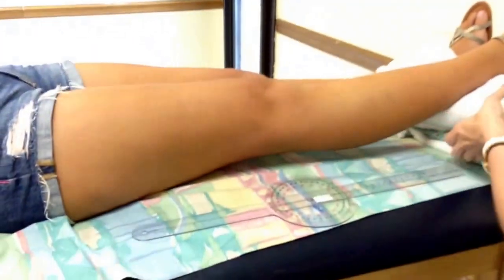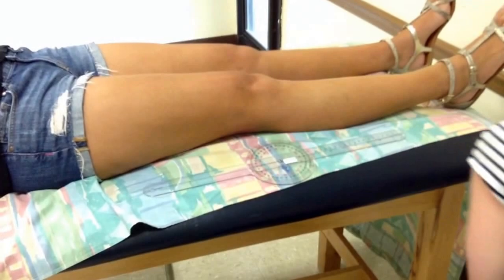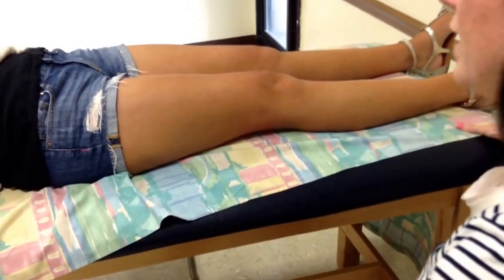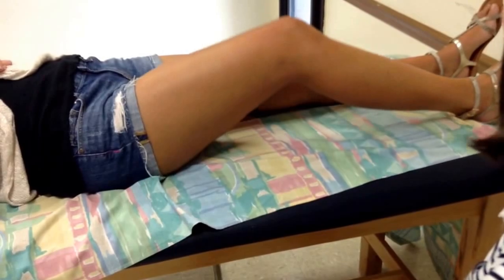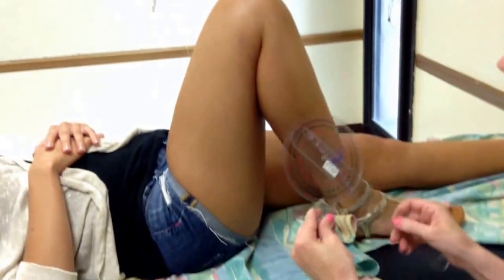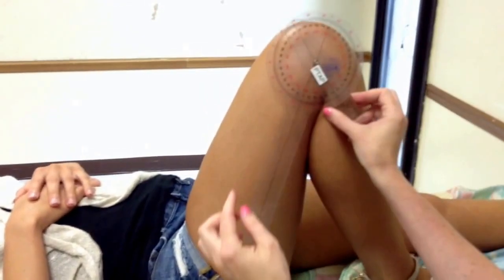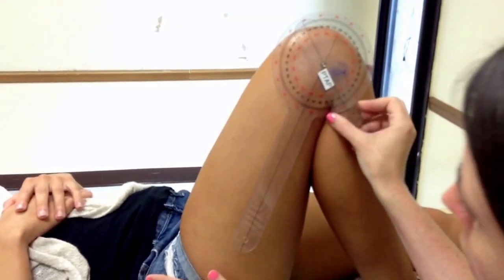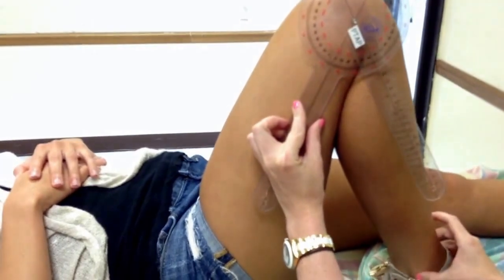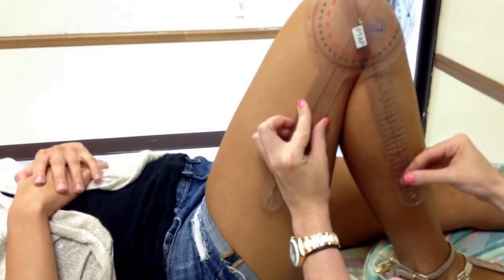Then I'm going to remove the toweling from underneath her ankle and foot. The instructions are: 'Can you slide the heel of your foot along the bed up towards your bottom as far as you can go?' Everything is lined up the same way — the lateral epicondyle of the femur is where your fulcrum goes, the greater trochanter of the femur is where your stationary arm lines up, and the lateral malleolus of the fibula is where the moving arm goes.